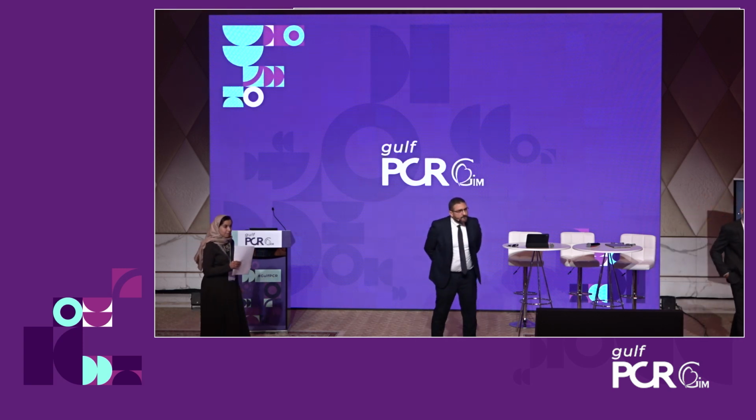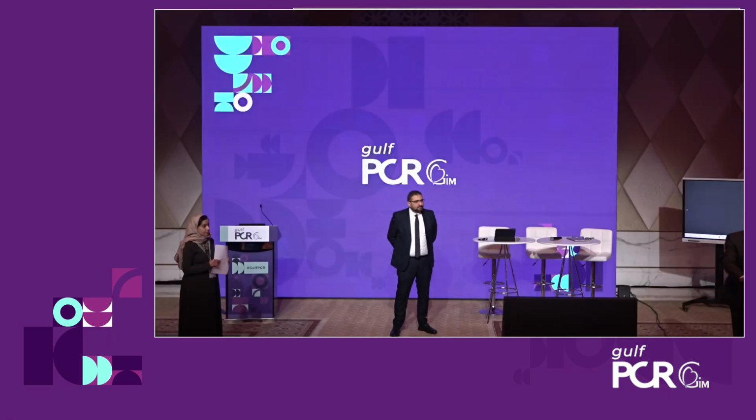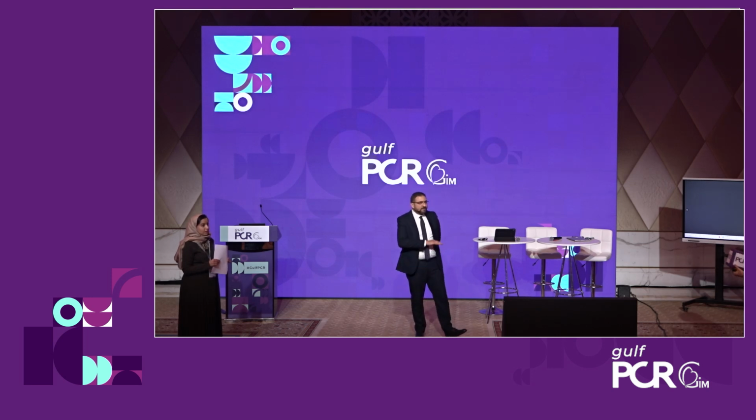I think, as the doctor insists, the second operator brings back the pigtail because he wants to insist on the position of the valve being held at the same strength as in the first and second part of deployment. Because when the operator brings back the pigtail, it may lose the tension. Right. So the first operator's job, as you mentioned, is mainly fixing the delivery system. The second operator takes care of the pigtail and the final release. Yes, the second operator does everything else.